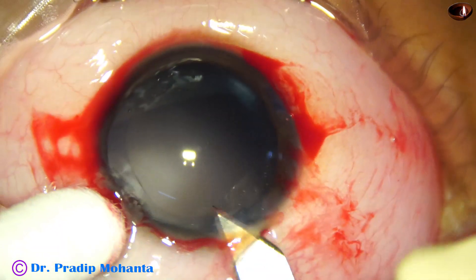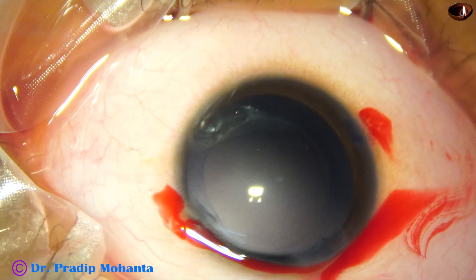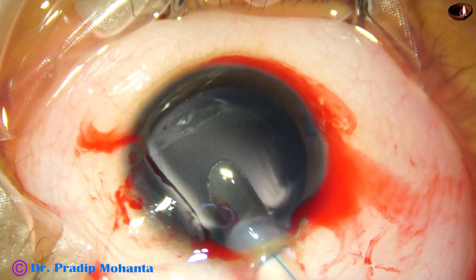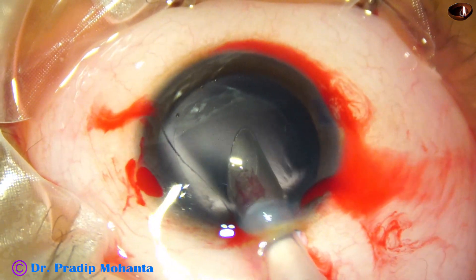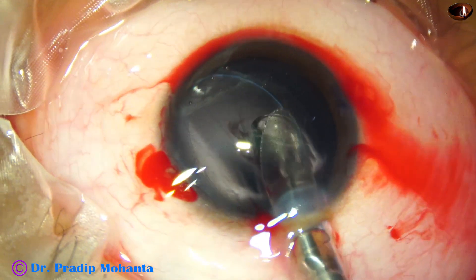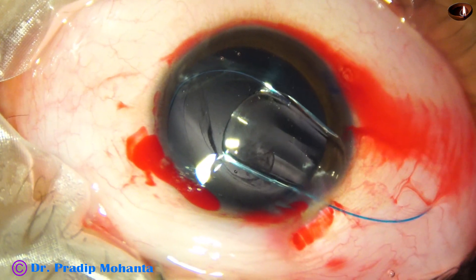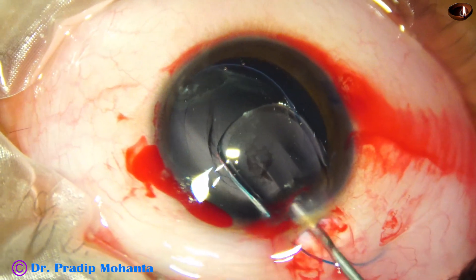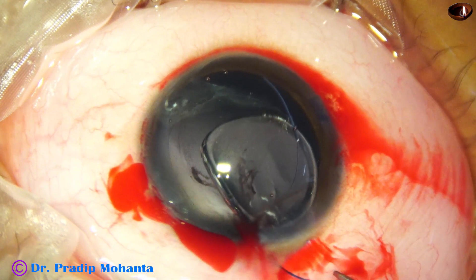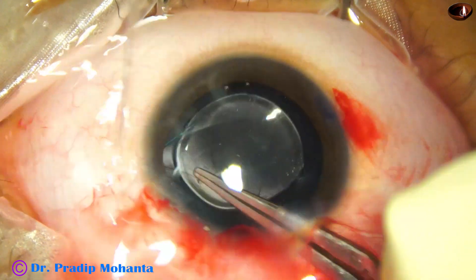The main wound is enlarged a little bit, because in this case I am going to implant a Sensar multipiece intraocular lens. The leading haptic enters. The cartridge is turned clockwise so that the haptic does not hit the posterior capsule and the haptic goes into the equator. Then the cartridge is rotated anticlockwise so that the trailing haptic is placed correctly.